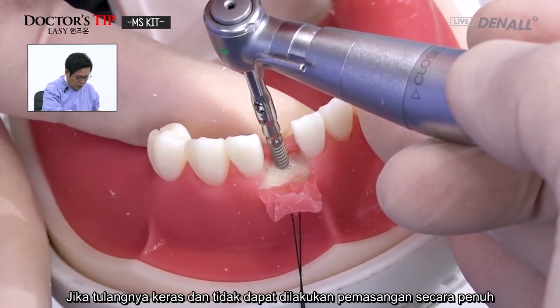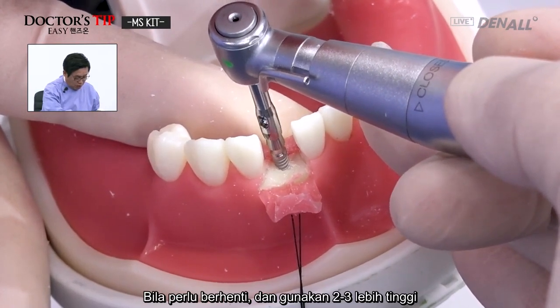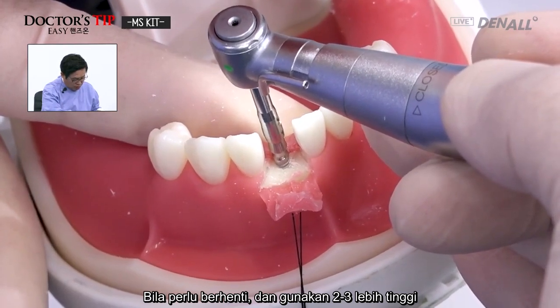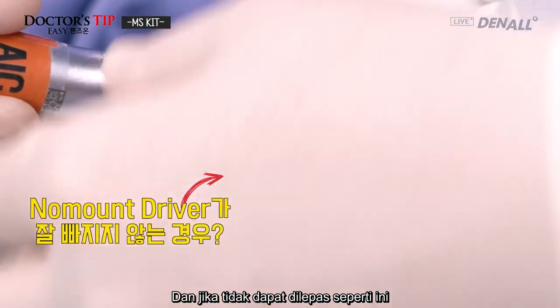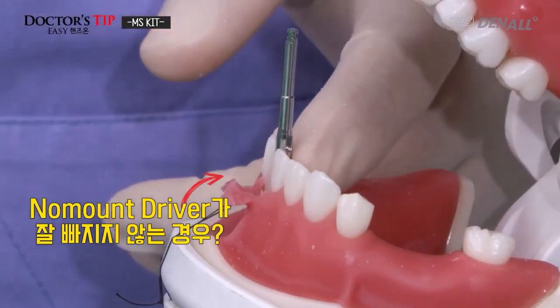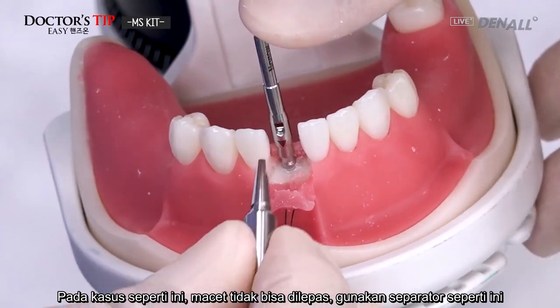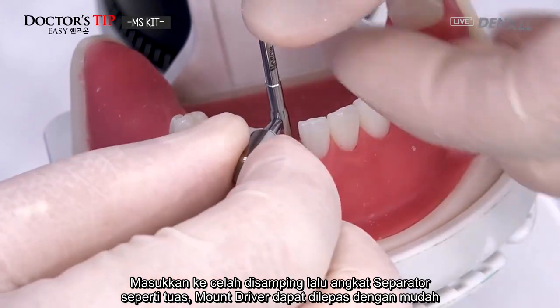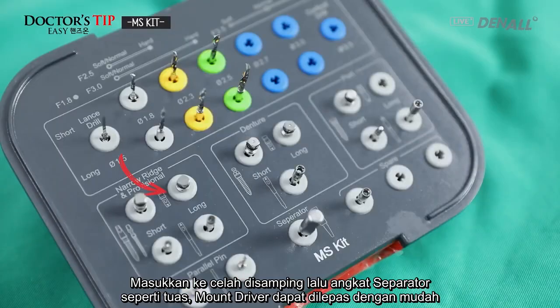If the bone is too hard and placement cannot be done fully, then sometimes you stop and you use a drill 0.3 level higher. You can use that even if it's not full length. And if you cannot take it out easily like this, in such a case, if there's jamming, then using the separator, you put it in the side and you increase lever action, then it can easily be disconnected or separated.